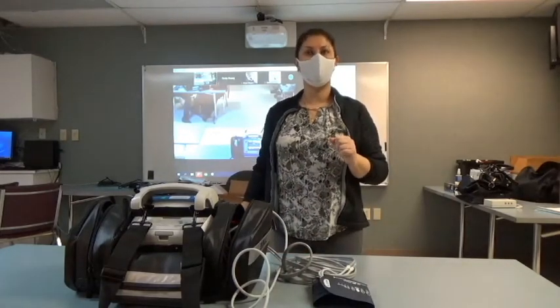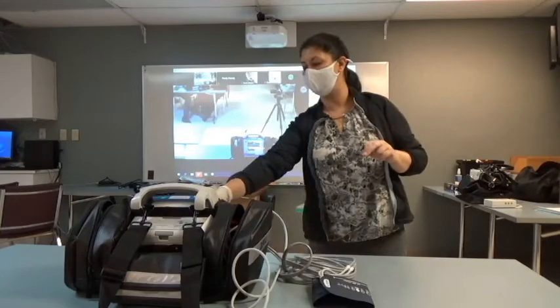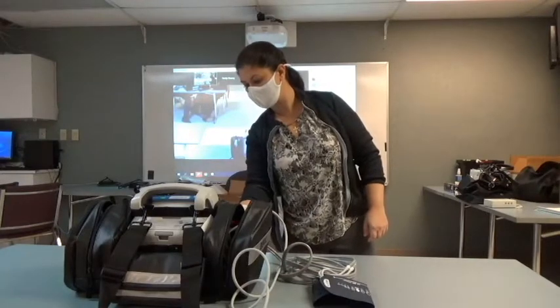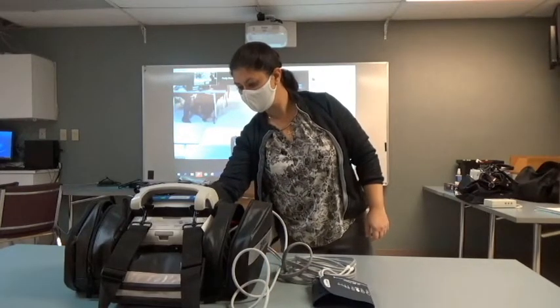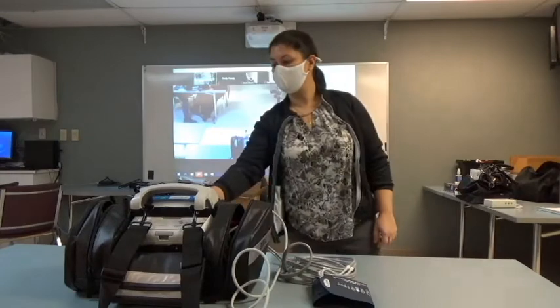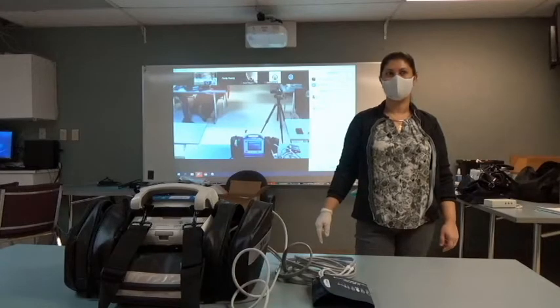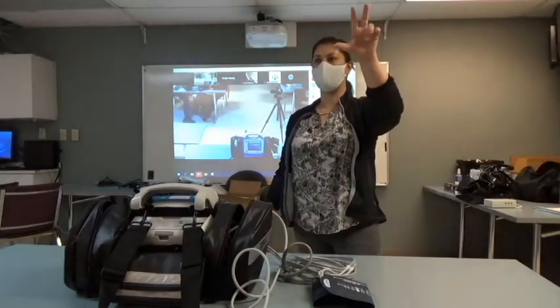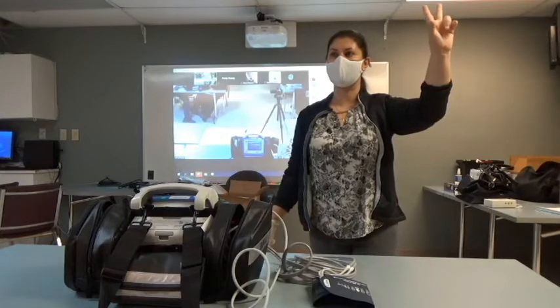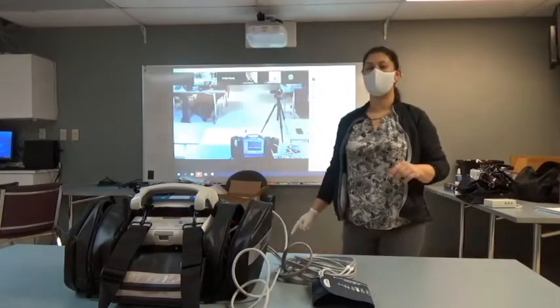So, your home button. Your home button will take you home, but it actually will give you three different screens. Go ahead and press your home button one time. You're going to get a list of vital signs trending. Press your home button one more time, and you're going to go to my favorite screen, which is a large numeric display. To recap, you're going to get three screens. One is your waveform. Number two is a vital signs trending window. And number three is large numbers. Everybody good? Home button one more time to bring us to our waveform.